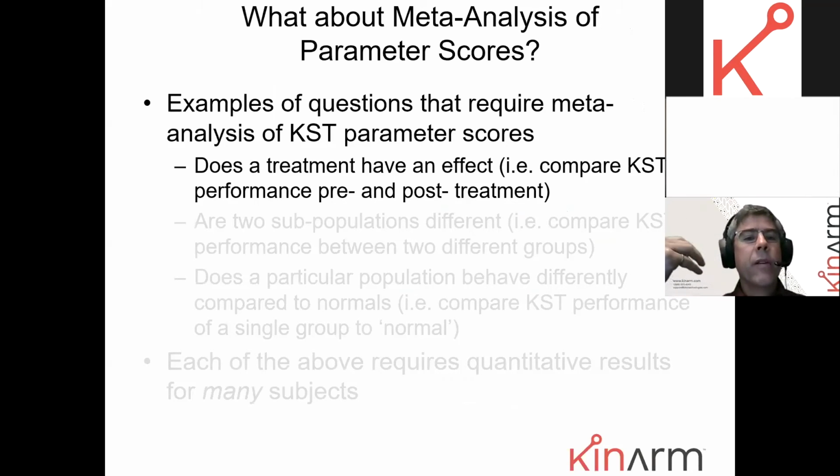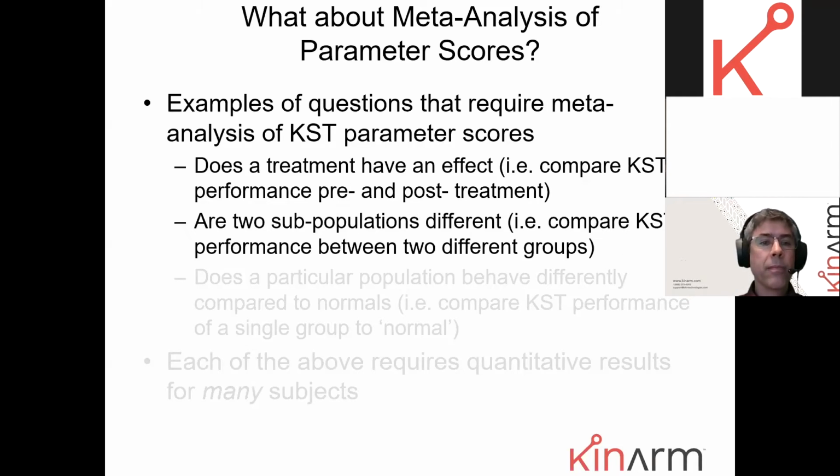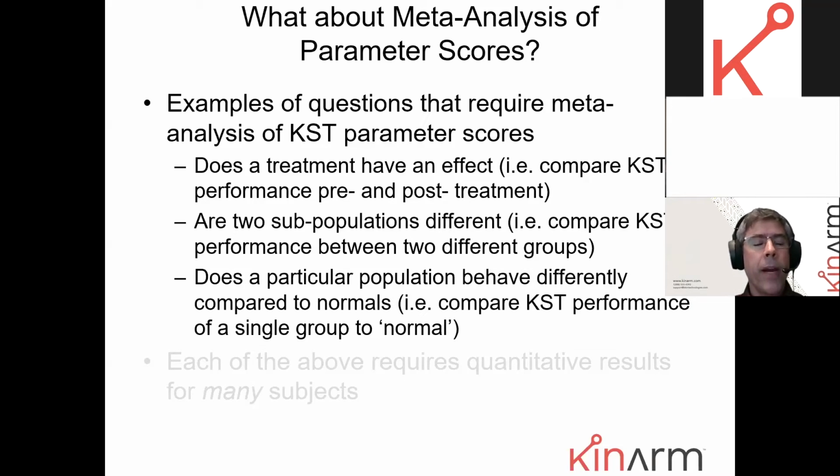Maybe you're interested in whether or not a treatment has some effect. So you want to measure performance or behavior before giving some type of therapy, and then look at it afterwards to ask the question, did my therapy help? You might be interested in comparing two subpopulations, for example, people with a migraine versus people with a stroke.